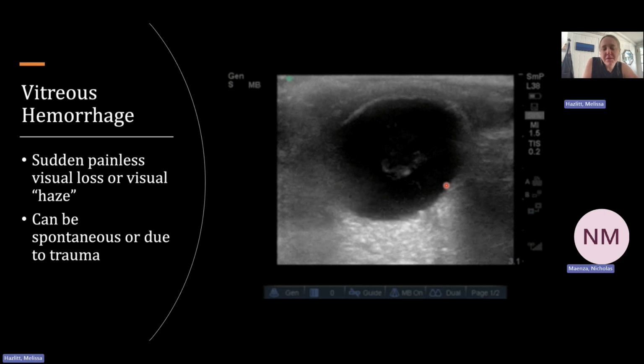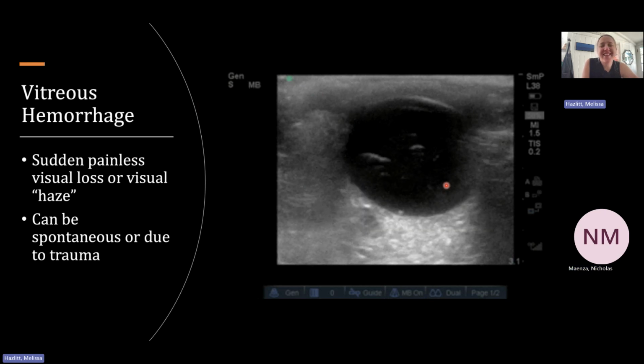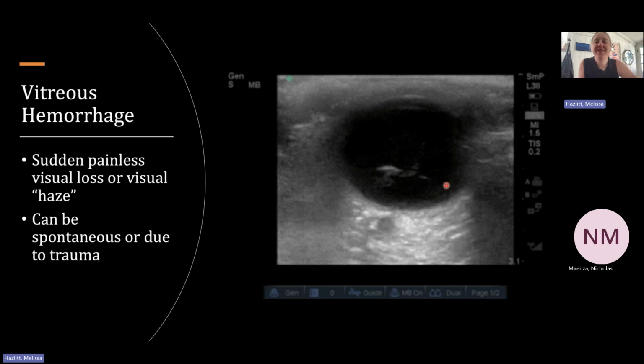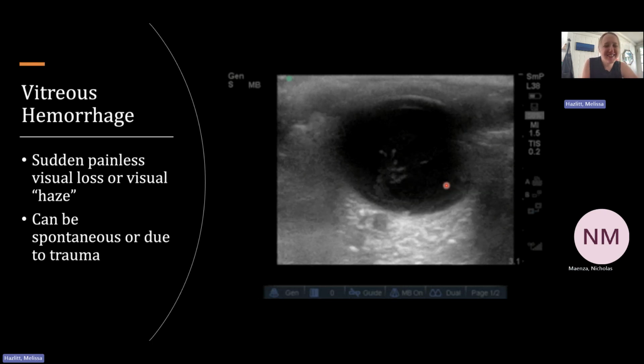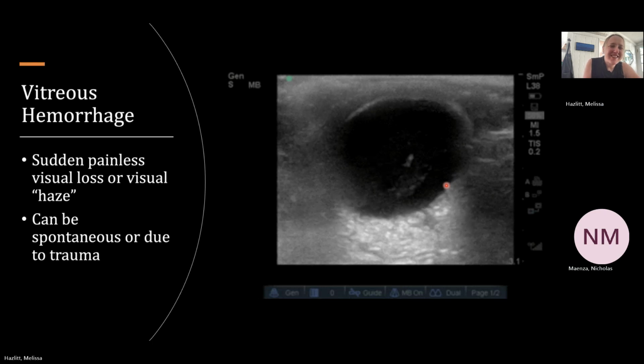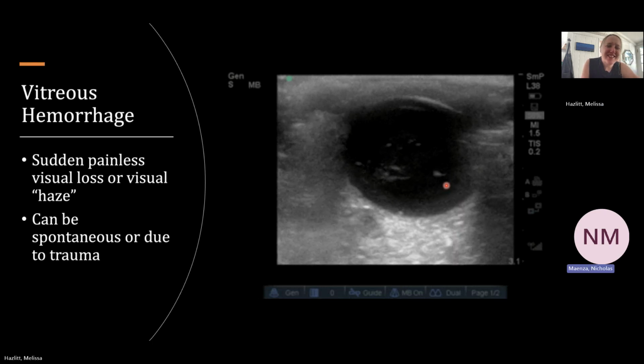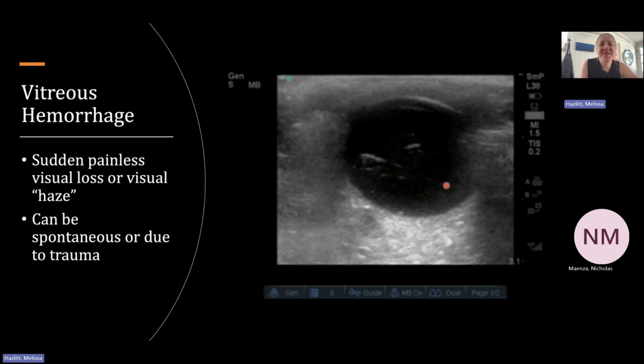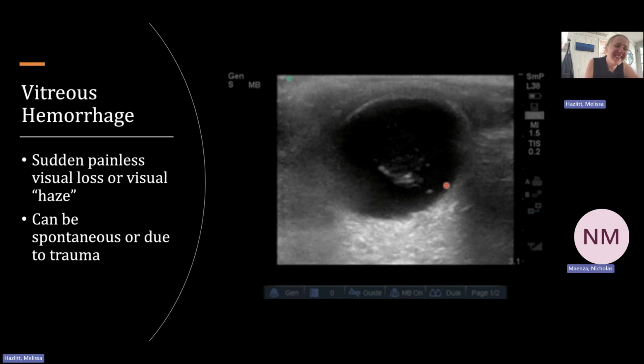And again, very similar symptoms. The top-loading washing machine sign? Yeah, you don't see anything, honestly. It just shakes and rumbles. Was that first eye the one that was glitching? Just shaking. Yeah, that's actually the top-loading washing machine. Gotcha.